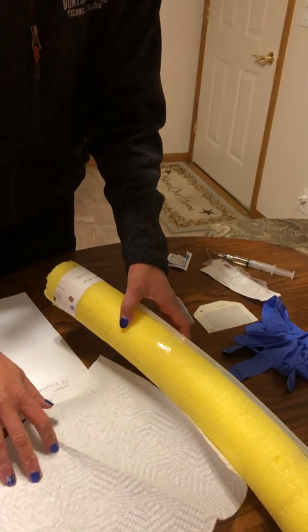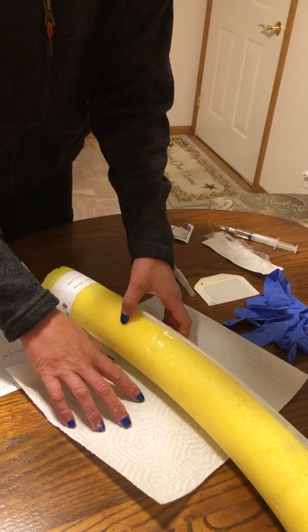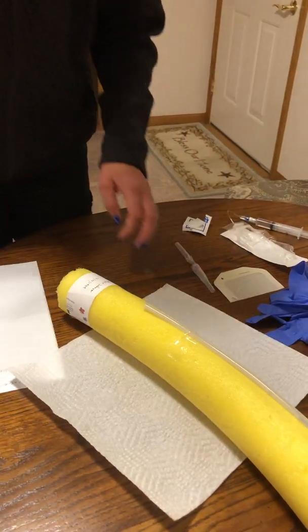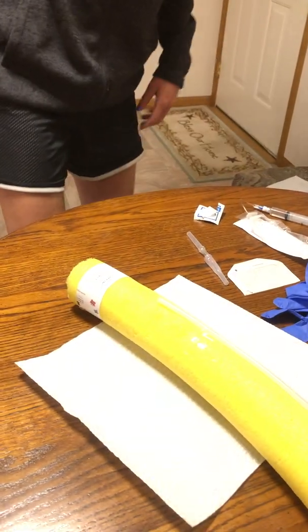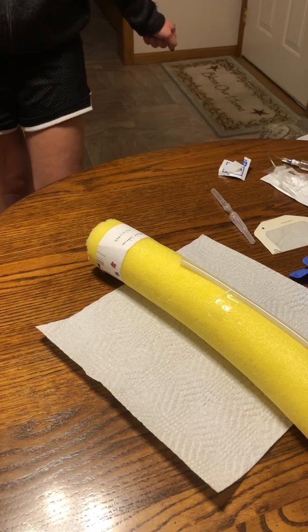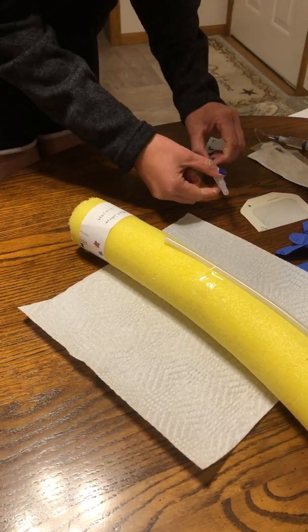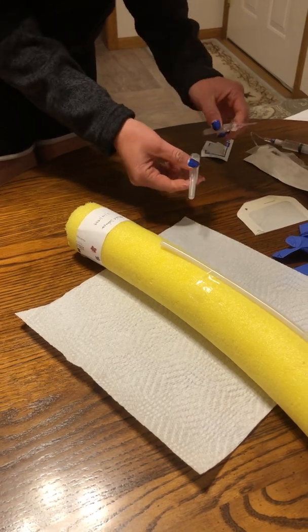Okay, so next, now that we did that, I'm going to ensure that we lift up to make sure that there is a towel underneath the insertion site. And then I'm going to ensure that my caps are nice and loose.